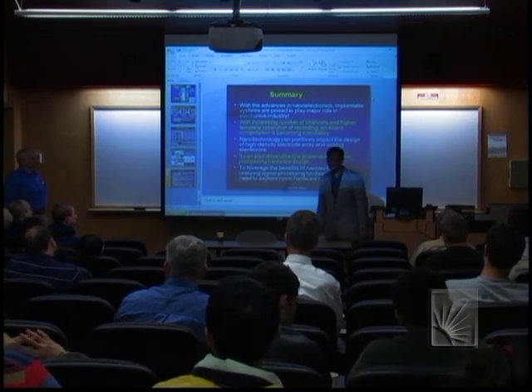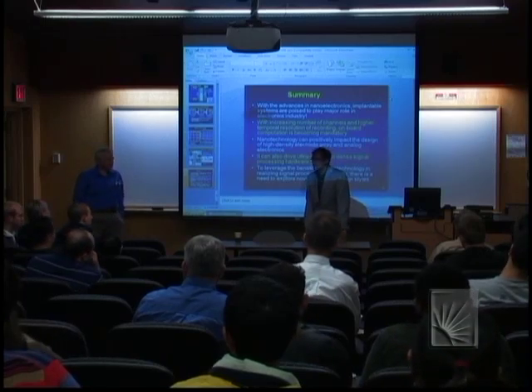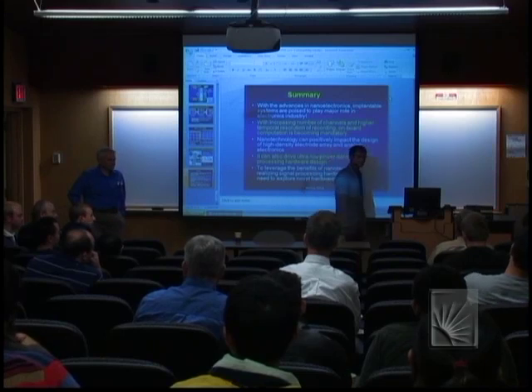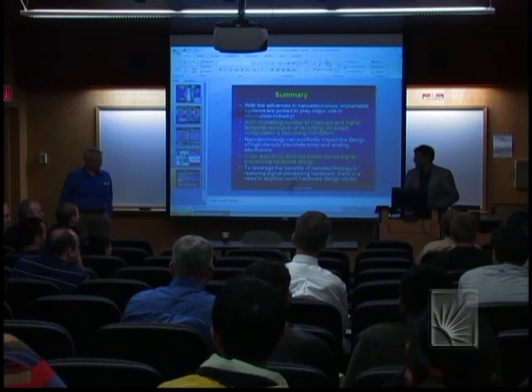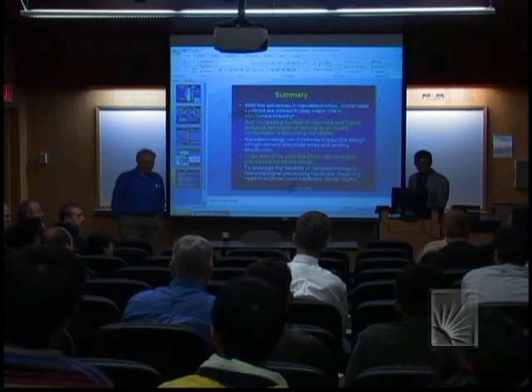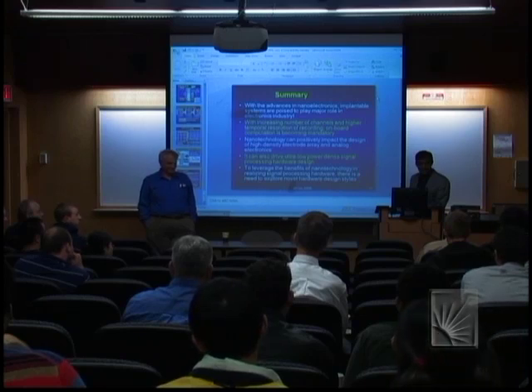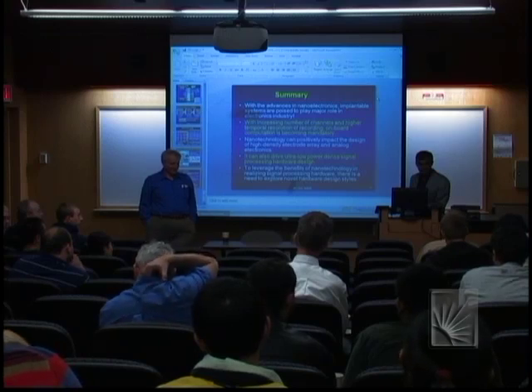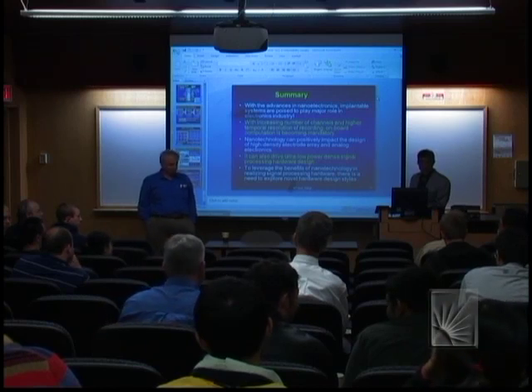we can have a lithium-ion battery, and Steve already has a system which is based on lithium-ion battery. I think Darren is looking into recharging from outside, inductive recharging. You can get some very small batteries. There's one that we're using. It's 3 milliamp hours, lithium ion, and I can't remember the dimensions, but it's perhaps a 10 millimeter long cylinder, about 1 millimeter in diameter. So they're making some very tiny batteries for these implantable devices. It's 3 milliamp hours at 3 volts, so we're talking about 10 milliwatt hours.